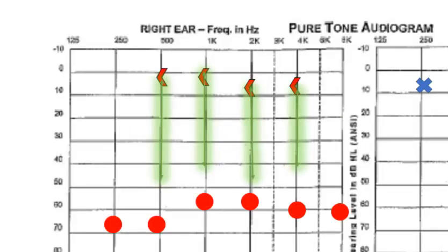Here is a moderately severe hearing loss, and we have air conduction thresholds shown on the right ear. We see the min-IA values superimposed on the air-bone gaps. Turner's observation is that the IA in this situation must be greater than the min-IA values that we keep in mind as reference for attenuation.